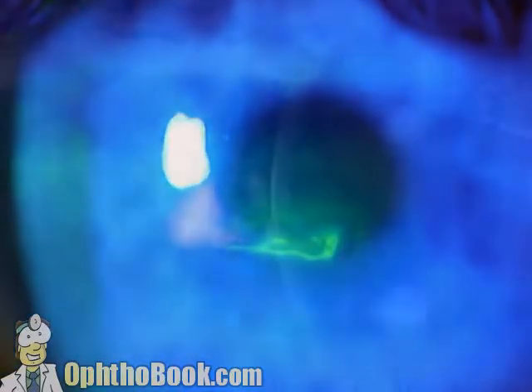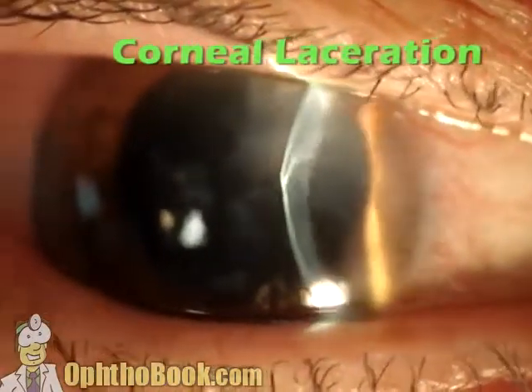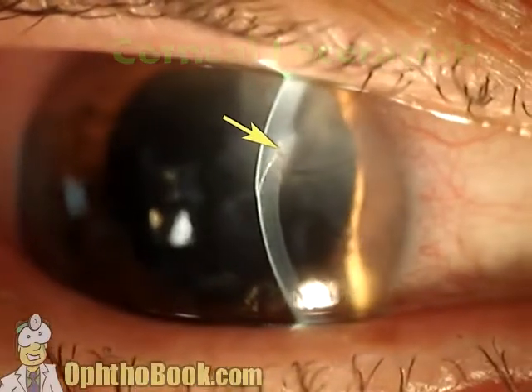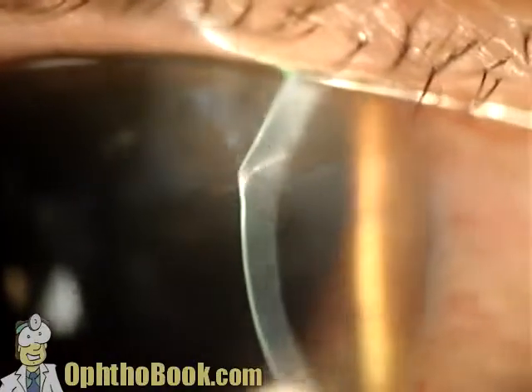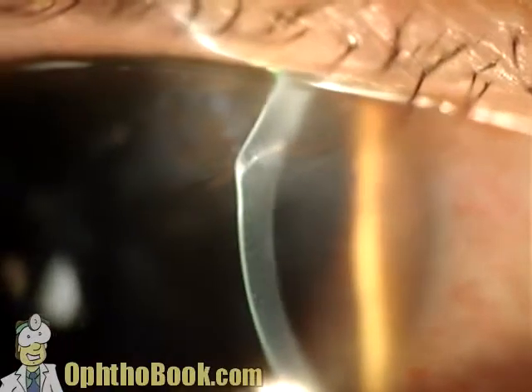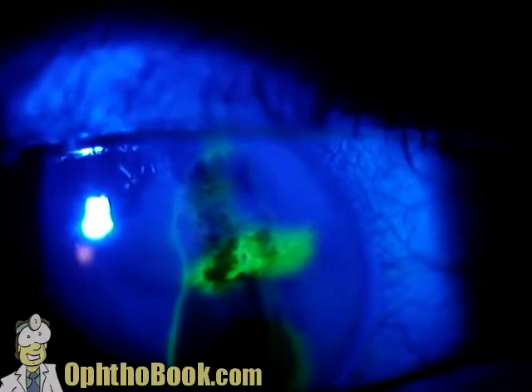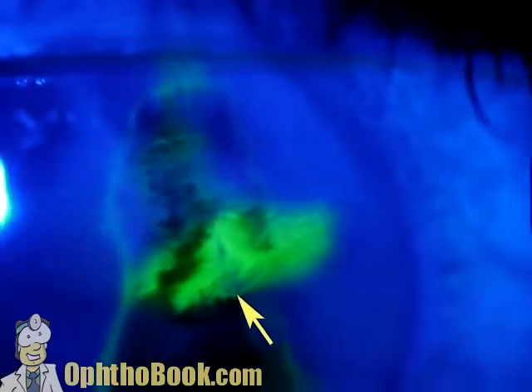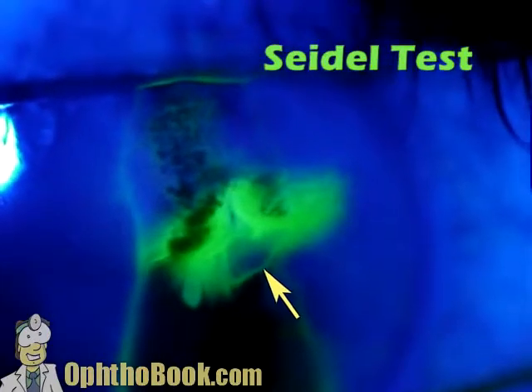It's also useful for finding leaks. This is a patient who has a corneal laceration — a nail through the eye. We know it's a laceration because you can see a line going from the front of the cornea to the back. The question is, is it leaking or not? It's hard to tell just looking at it. So we rub some fluorescein on the surface and look for leaks — and you can see that leak right there where the fluorescein is being diluted. This is the Seidel test.